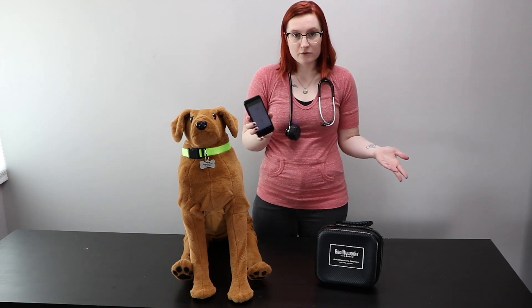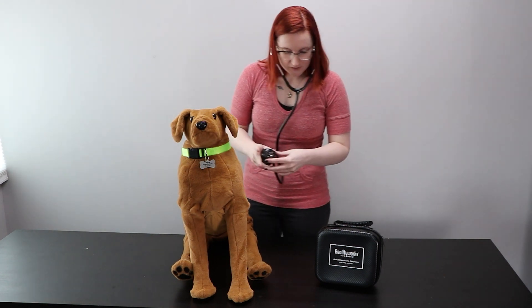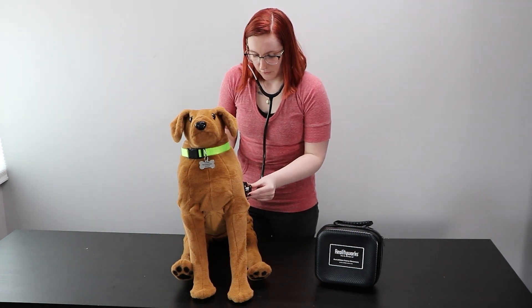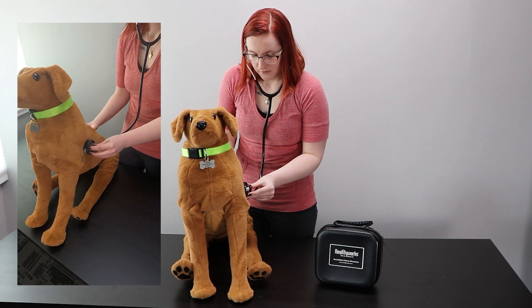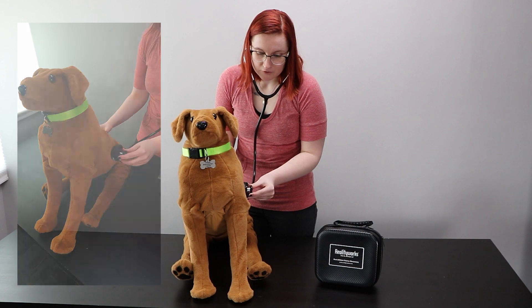For this demo we're going to work in practice mode, and I'm going to select the slow heartbeat sound. From the diagram I can see where I need to place the stethoscope, and I can hear the slow heartbeat through the stethoscope ear tips.